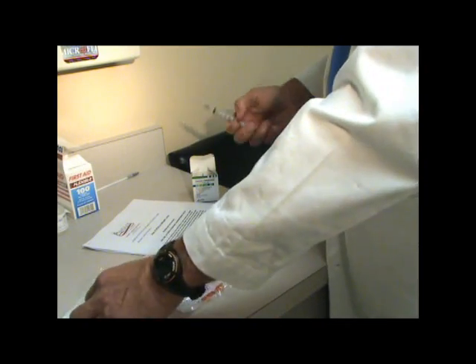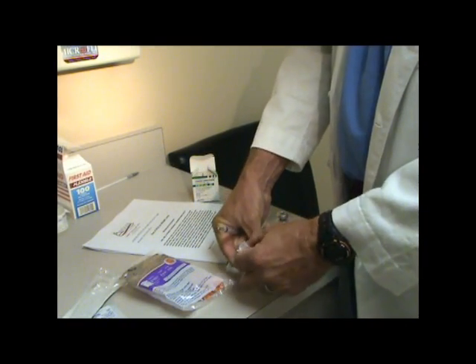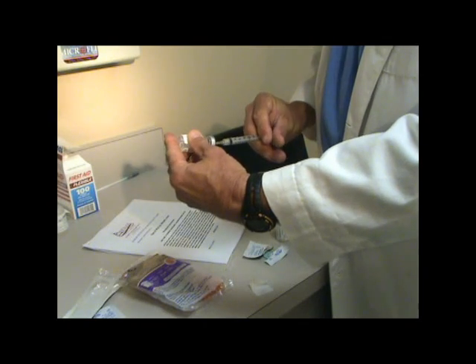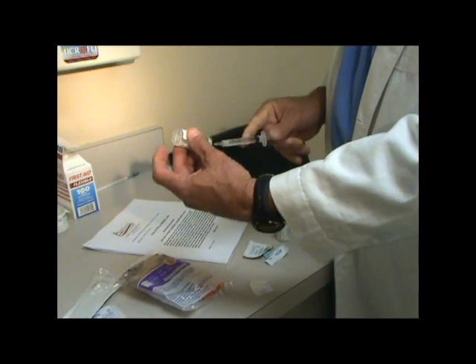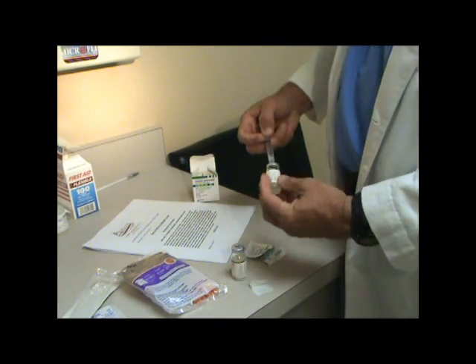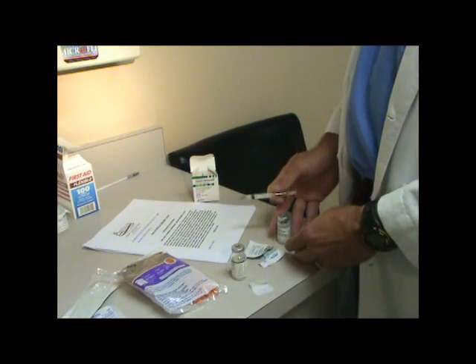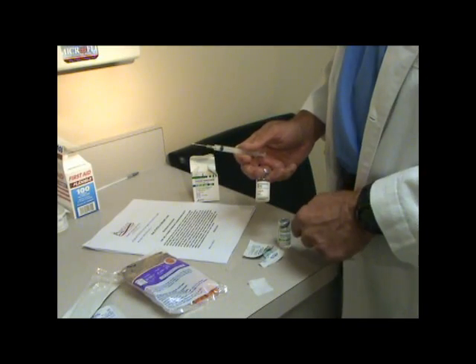That's the first time through. Now, the second time through, you can use an alcohol sponge, drawing the air up and injecting in. It just makes it easier to draw the water back a little more quickly. Rotating as you inject. Then you complete this using the entire volume — the entire amount in the syringe — to fill into the powder.